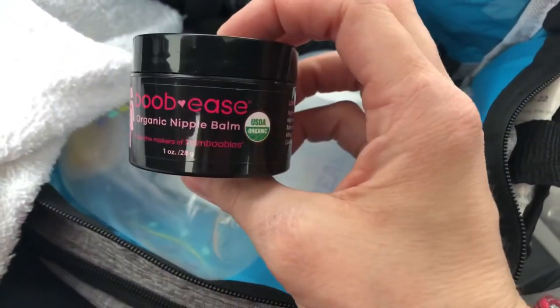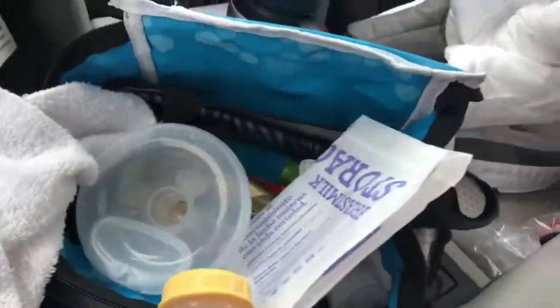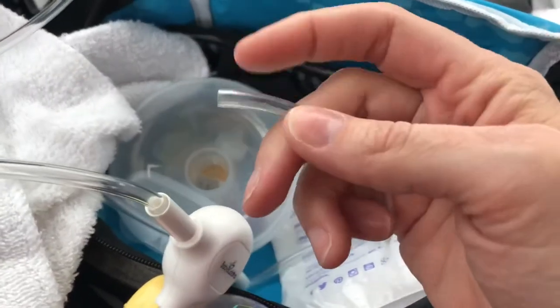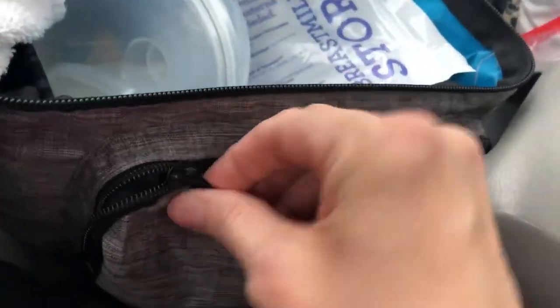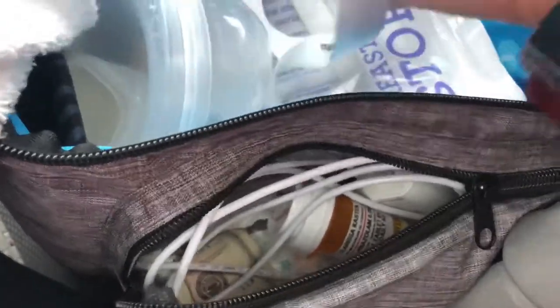What I do is I put some of this boob-ease on each of my nipples and then put these on. Then my tubing right here — Baby Buddha tubing — and this piece just fits right into the shields. The other part, which has the little connector piece on it, fits right into the Baby Buddha pump, which I have right here in the front zipper portion to keep it separate from all the liquid stuff, along with the charging cable.